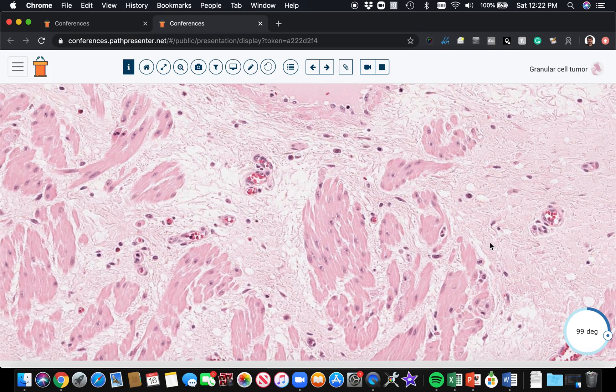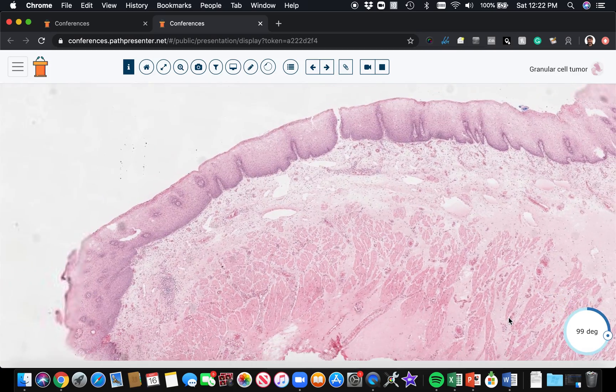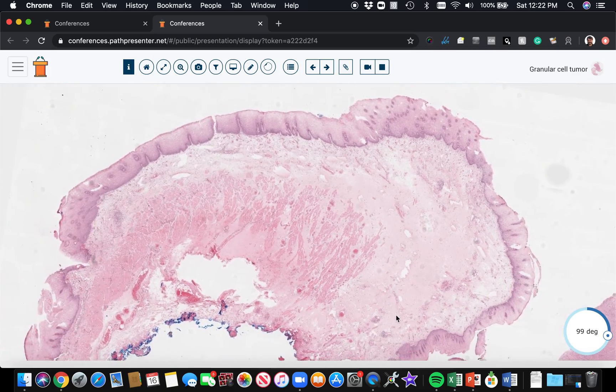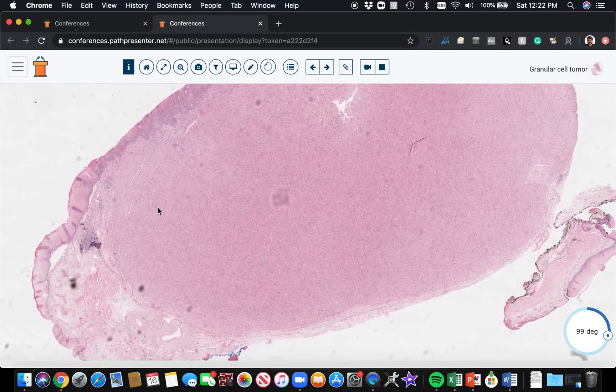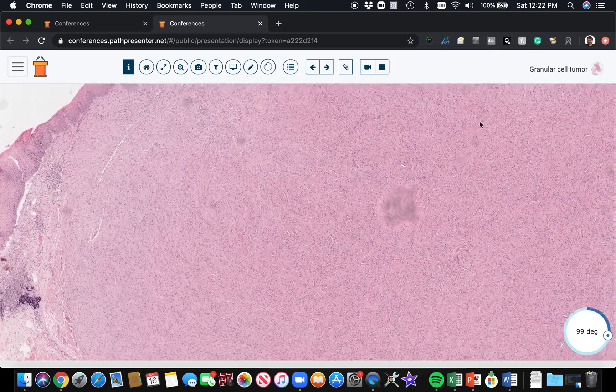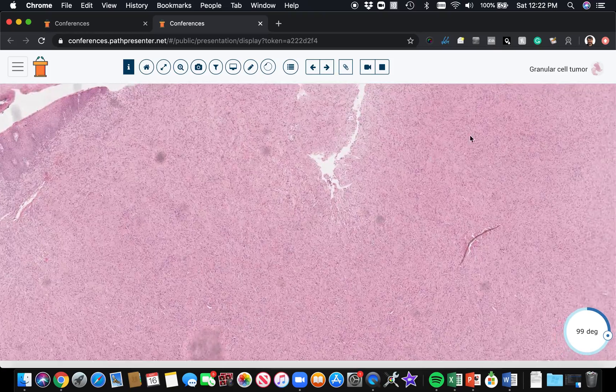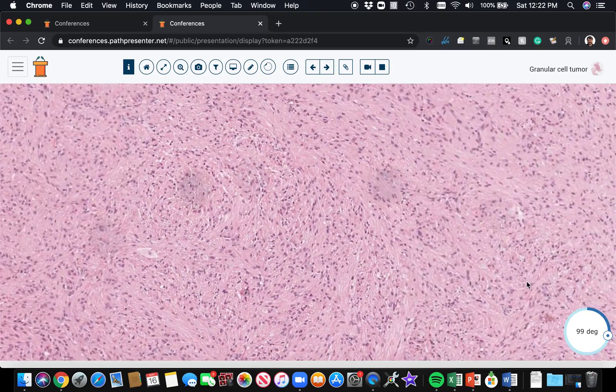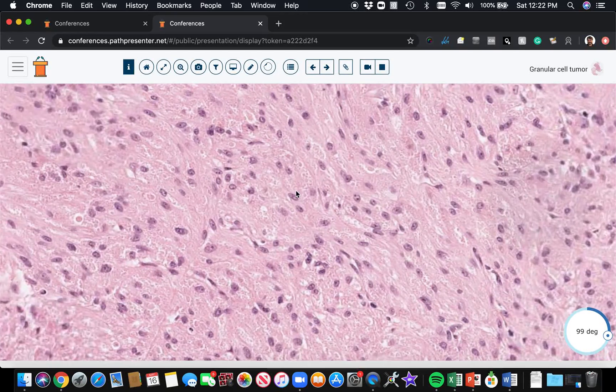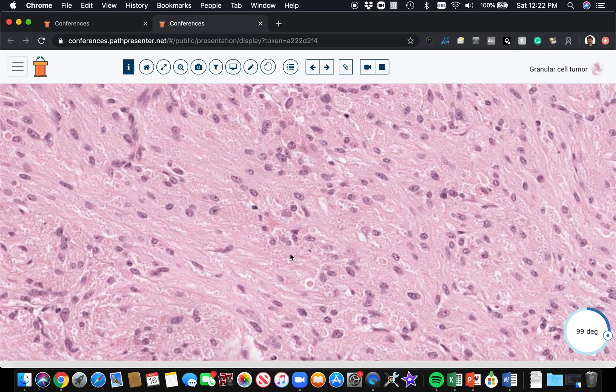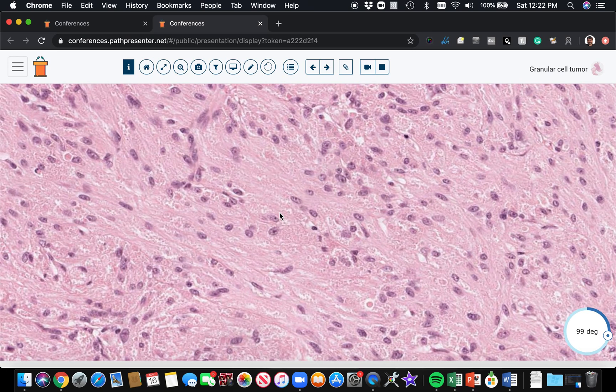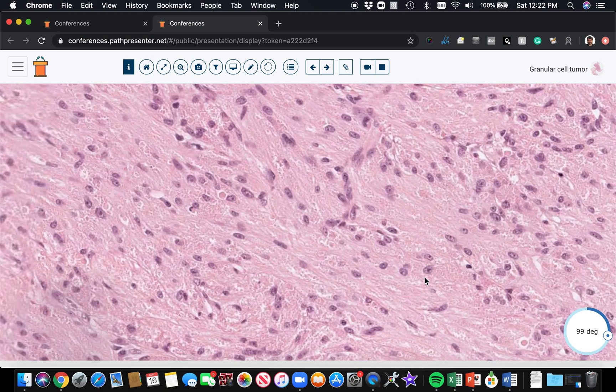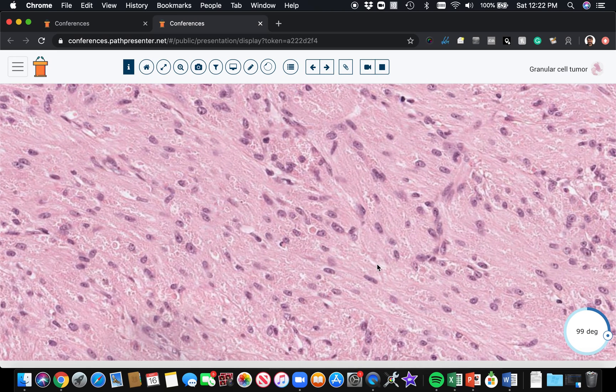What we have over here is a nodule right beneath the mucosa, and the cells have kind of oval to round nuclei with fine chromatin and a tiny little punctate nucleolus, with abundant eosinophilic cytoplasm that has a granular appearance. It's kind of hard to appreciate on this scan, but it's kind of a grainy, granular appearance.